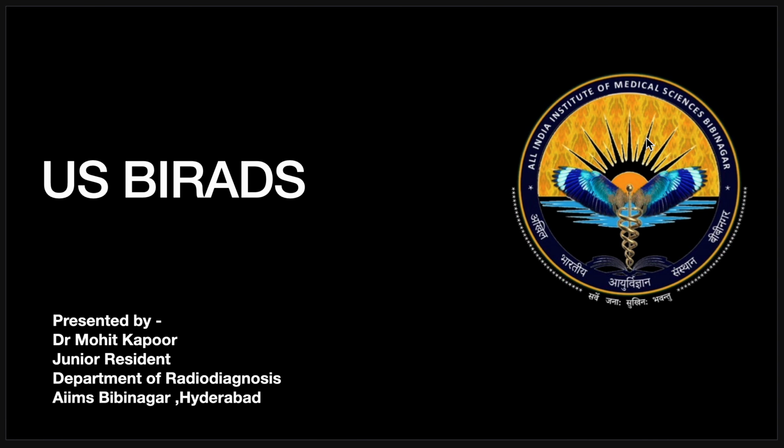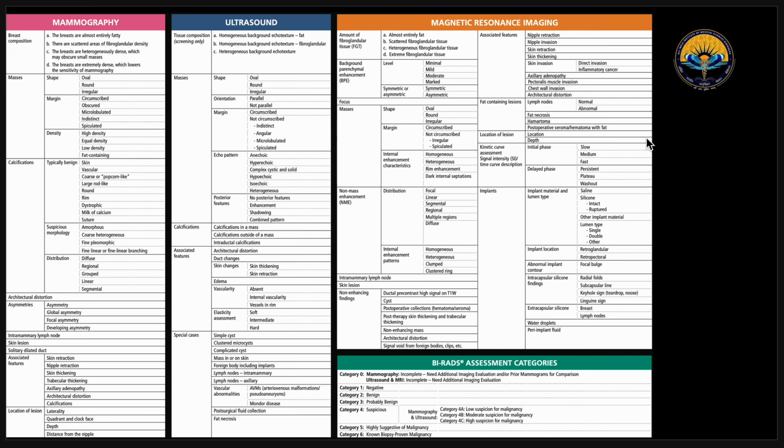Now coming to BIRADS. So we have three main modalities. We have mammography, we have ultrasound, we have MRI for breast lumps, and we have various features on all of these modalities. And we have BIRADS categories for mammography, ultrasound, and MRI. But for the sake of this discussion, we are just going to study ultrasound BIRADS categories. And depending on the features which you see here, we characterize the breast lump or breast lesion into category 0 to category 6.